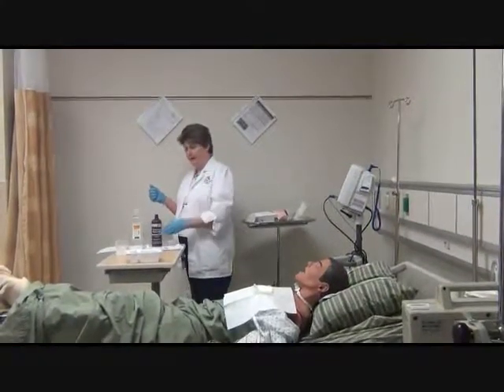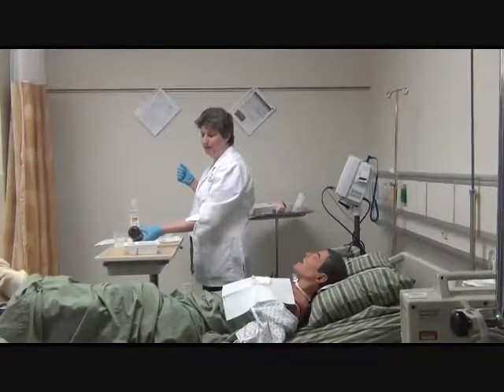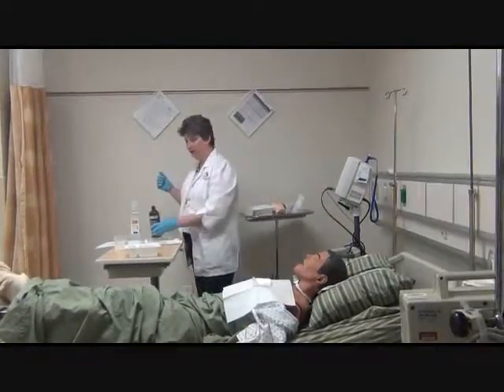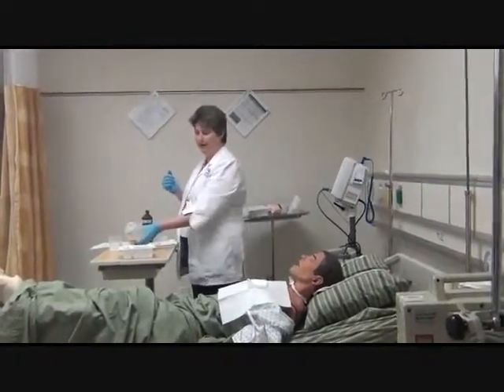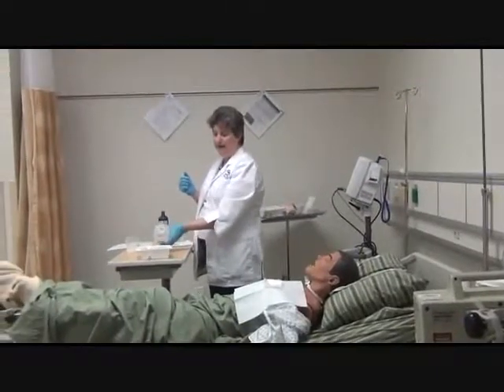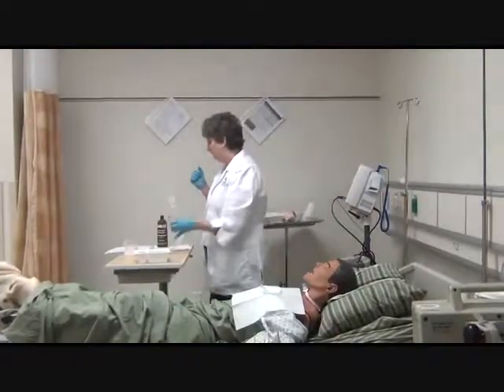So again, my clean hand, I'm going to pour hydrogen peroxide in the back. I'm going to half and half that with the saline, and then I'm going to make basically a rinse bowl with the larger.